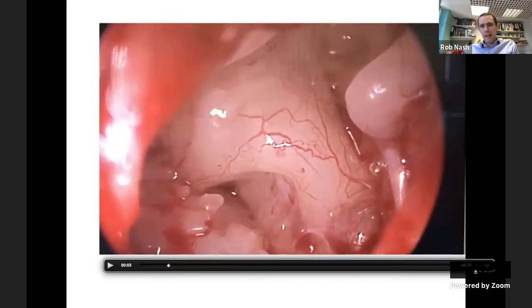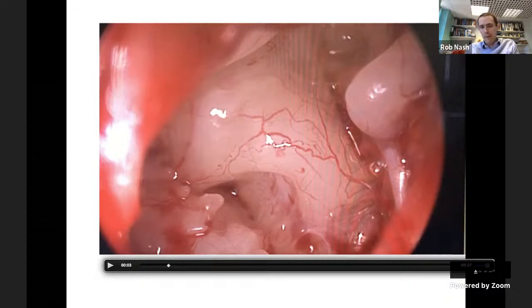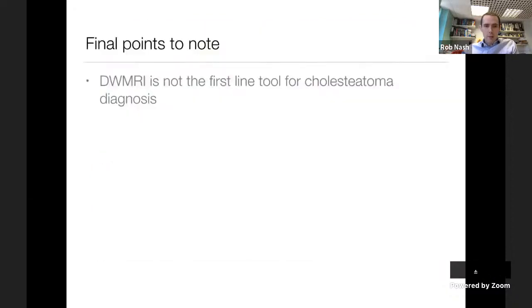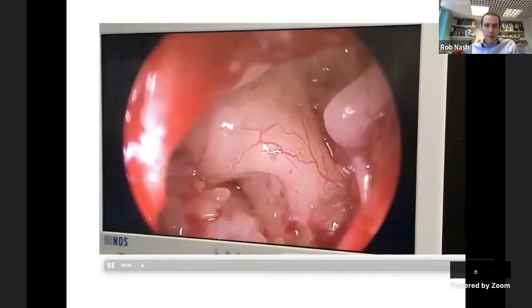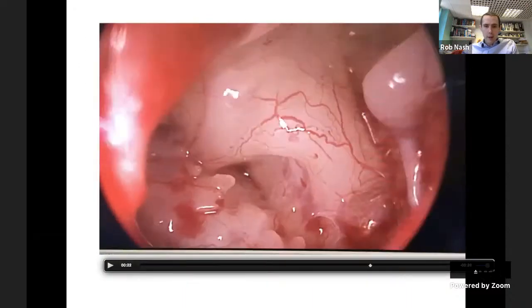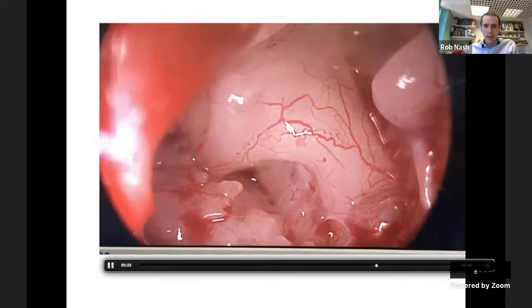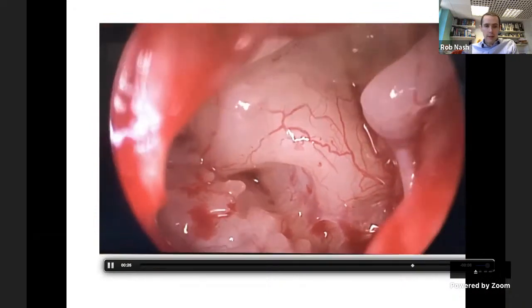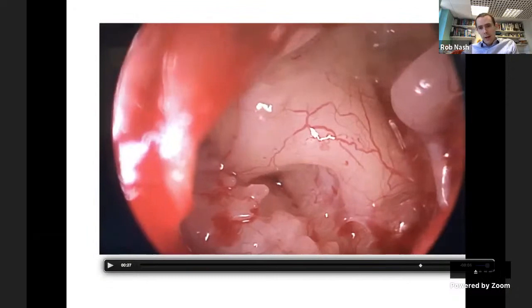This is an exploratory tympanotomy looking for a perilymph fistula. A patient has unusual balance symptoms thought to be secondary to leaking fluid from the inner ear. The examination involves looking with the patient straining to see whether fluid is leaking from the round window. You can see what a beautiful view exploratory tympanotomy can give you, even of the vasculature over the promontory.